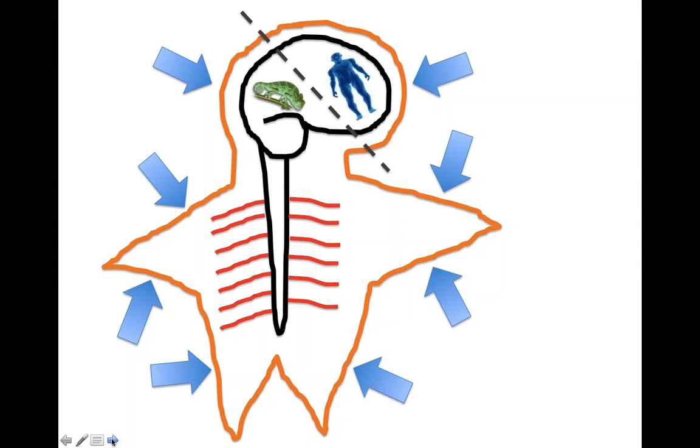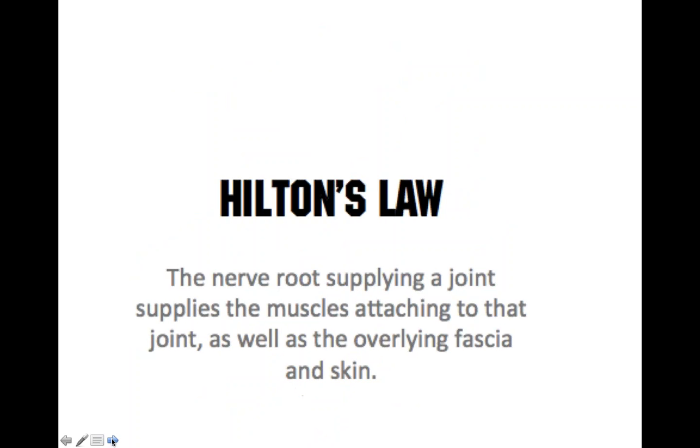So with the advent of using tools and various stroke rates, it's a great idea to mitigate pain and to get past this idea of threat. And threat is a big thing. I say threat and pain go hand in hand, and it's up to us as clinicians to mitigate that or downregulate that. So information coming into the skin, changing it.